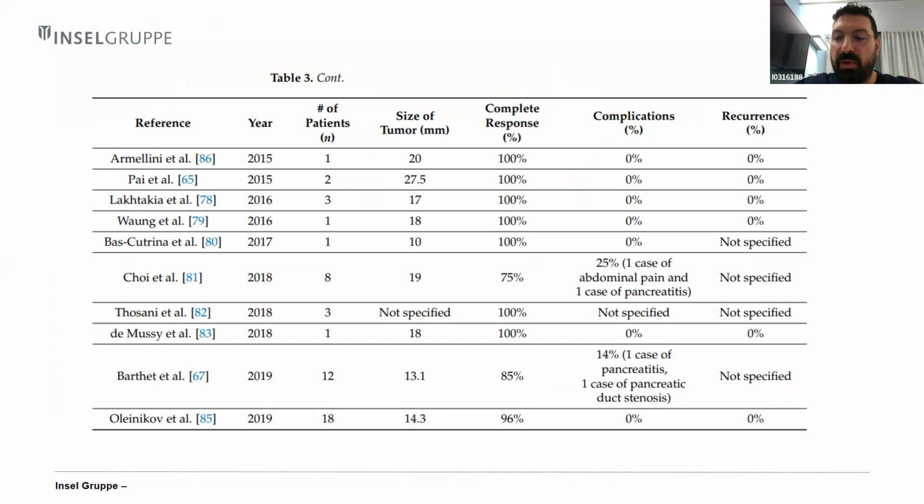Recently, a larger multicenter study on the EUS RFA of PANNET substantiated these earlier studies regarding efficacy, feasibility, and safety. Bachte and colleagues reported a prospective study of 28 patients undergoing EUS RFA for either PANNET or pancreatic cyst.